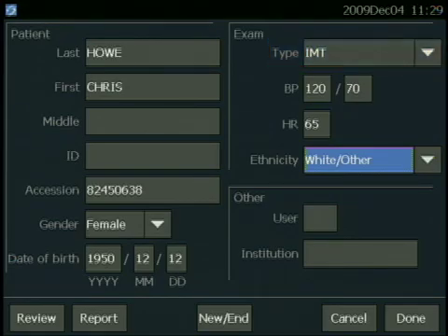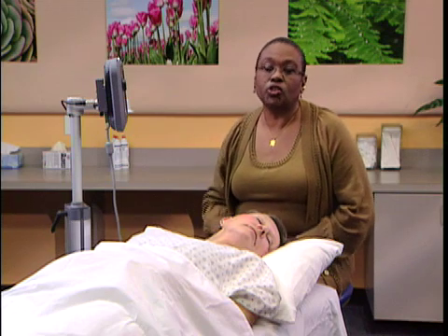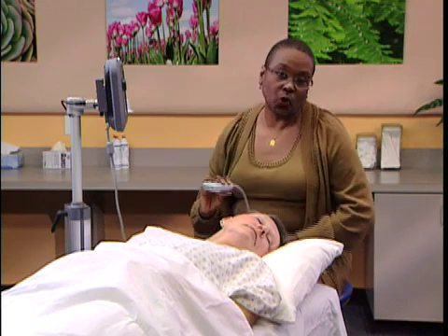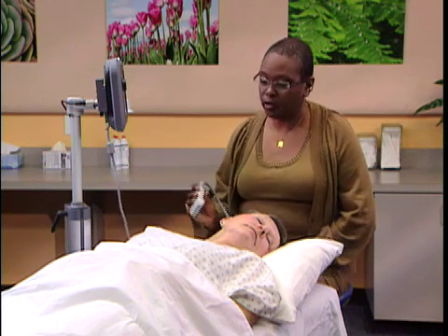Once you get all that information input, you can begin your study, and when the study is completed, that information will automatically be populated into the patient report for sonocalc.